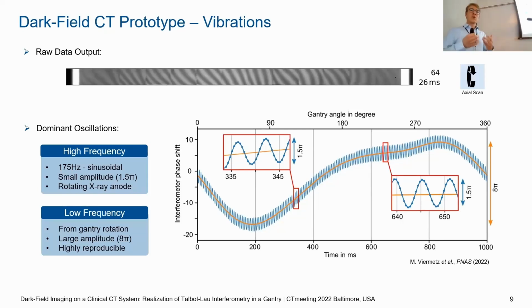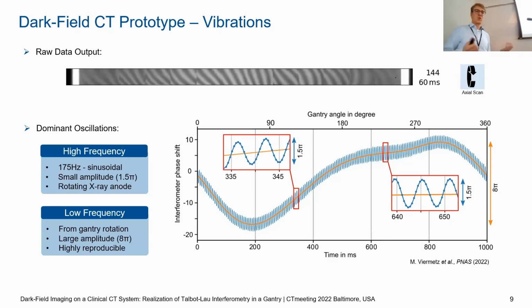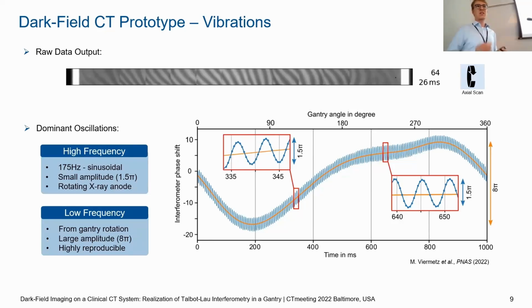And fortunately, both of these frequencies can easily be resolved with this high detector frame rate, and we can process them or include them in our data processing and even take advantage of these oscillations, as you will see on our posters tomorrow.